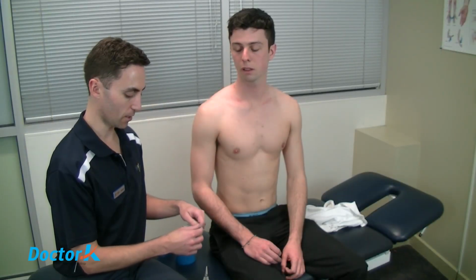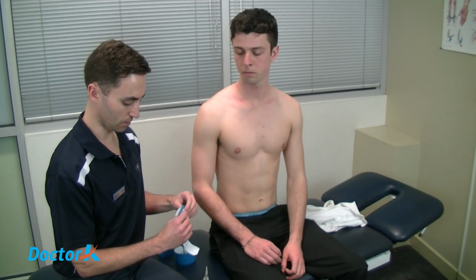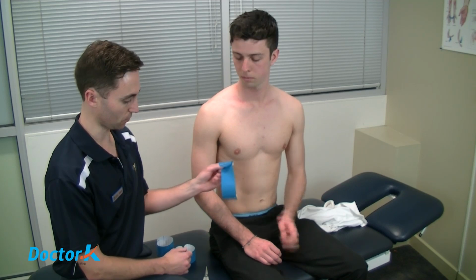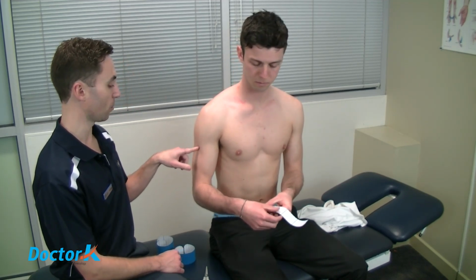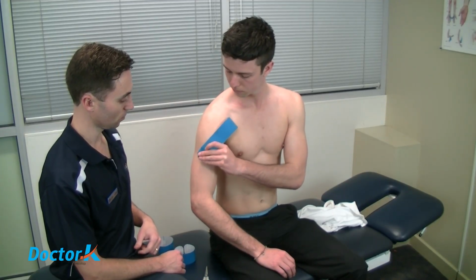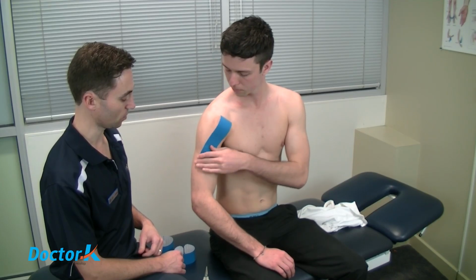So we're going to fold our tape and tear along that fold to prepare the base piece, create a little tab for us to then peel off, pull that piece back to create our anchor point. I'm going to give Simon this to start now. And we're going to try and place our base piece at around that point of insertion of your deltoid. We're going across the front of your shoulder with this one. That's it. So give it a rub to make sure it sticks properly.